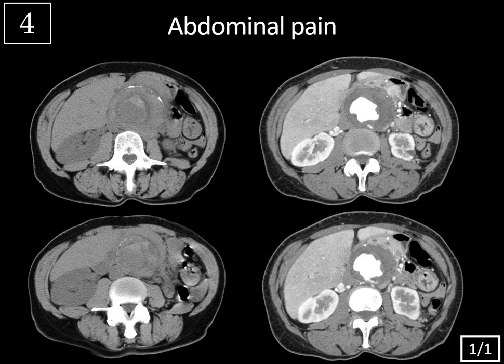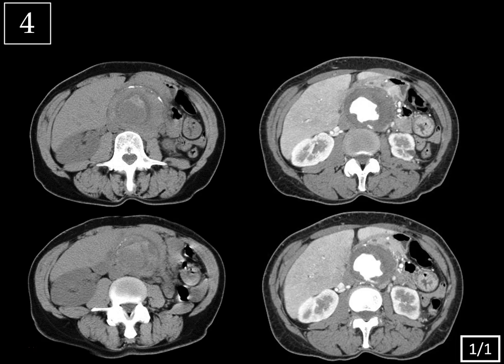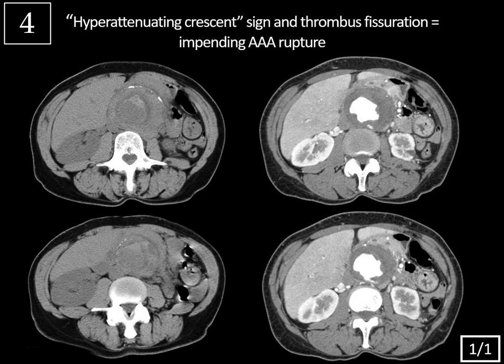Case 4: history of abdominal pain. On the non-contrast images, there's a very large abdominal aortic aneurysm with some peripheral calcification in the wall, and more importantly, heterogeneous hyperdensity within the mural thrombus, even more pronounced anteriorly. Looking more inferior, there's irregular hyperdense material within the wall of the aneurysm. With IV contrast in the angiographic phase, there's no contrast extending outside the aorta to indicate rupture and no surrounding hematoma, but there's fissuring of contrast entering into the mural thrombus, coming very close to the outer wall. This raises concern for impending abdominal aortic aneurysm rupture.